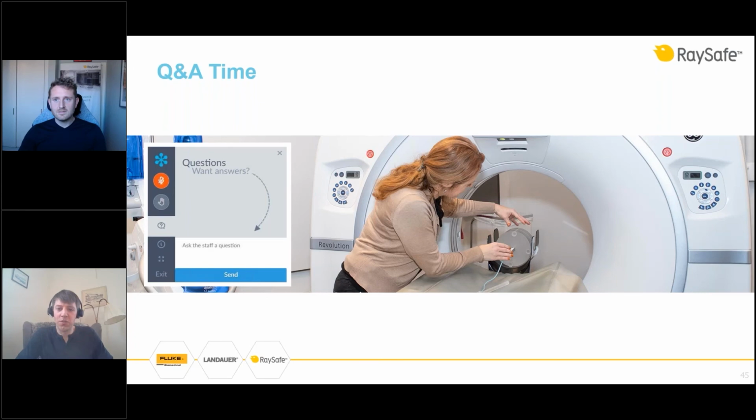You should measure what's called CTDI vol, and then you should compare this with what the scanner reports, and it shall not deviate by more than plus minus 20% or plus minus 1 milligray. So that's what you do during acceptance testing, or when you have changed tube or other major change on the scanner. And otherwise you should do yearly testing.